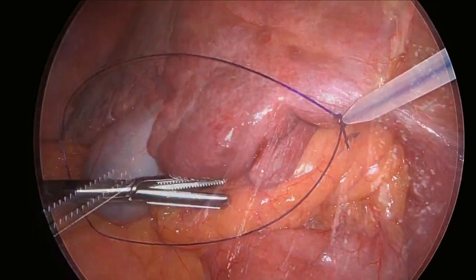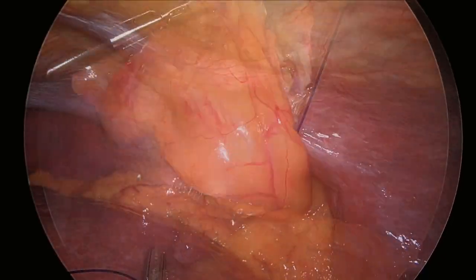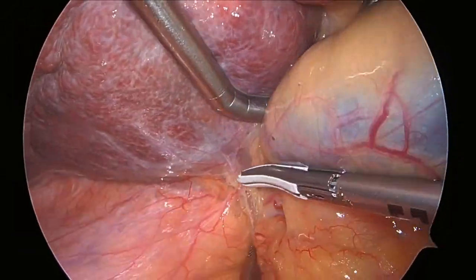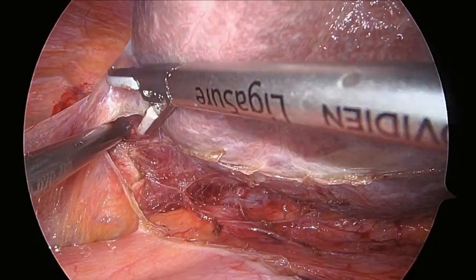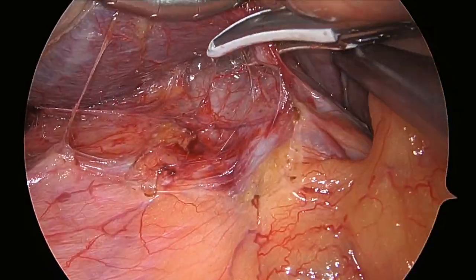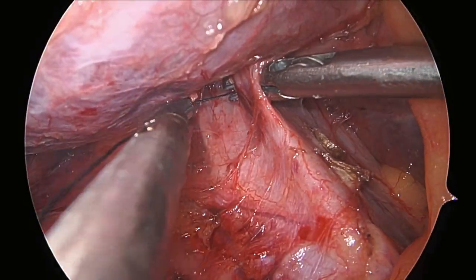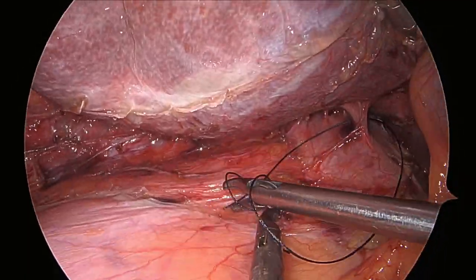Turning our attention more caudally, we like to help with right liver mobilization by encircling the round ligament with an endo loop and retracting it extracorporeally to the patient's left. We start by identifying the infrahepatic IVC and dividing all the retroperitoneal attachments, as well as continuing this out more laterally. The smaller short hepatic veins can be ligated safely with ligature energy devices seen here. For the larger short hepatic veins, we prefer to ligate between ties and hemlock clips.